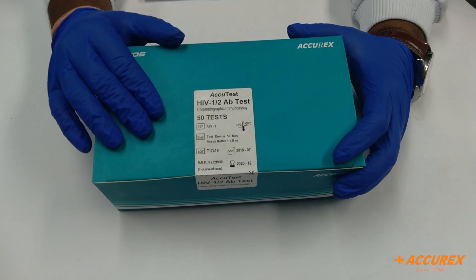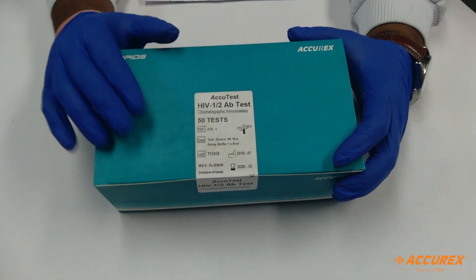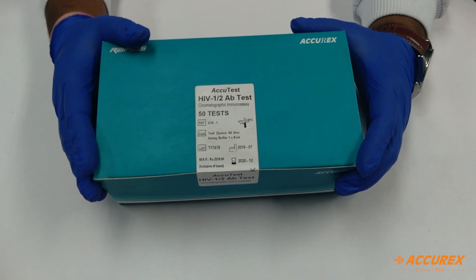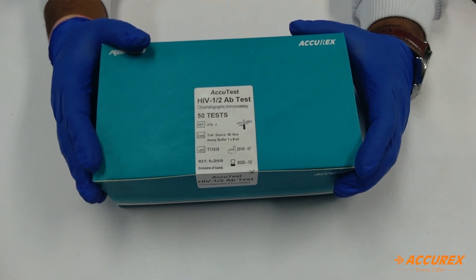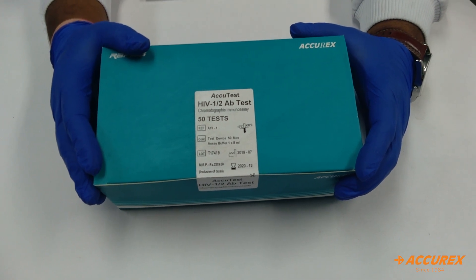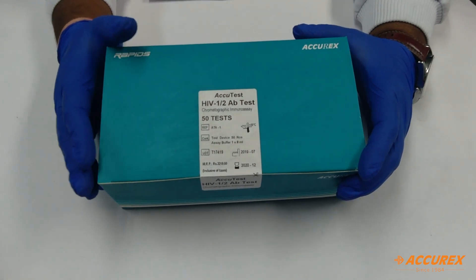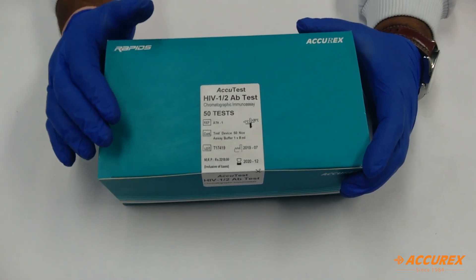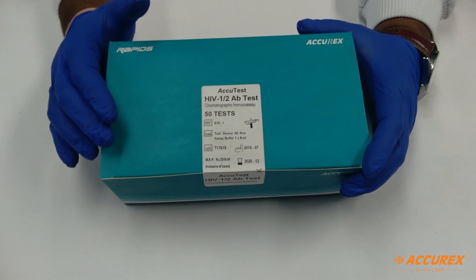You need to store this product at 4 to 30 degrees Celsius. Do not freeze the product. If any product is found damaged, do not use that strip or card. For the handling part, you need to handle the sample with proper gloves and proper precautions, since it is an HIV infection sample which may be infectious.